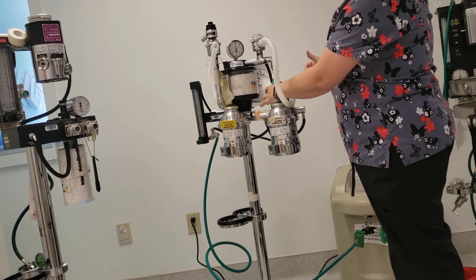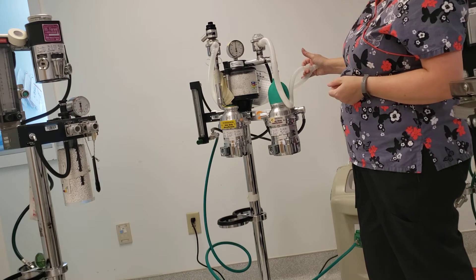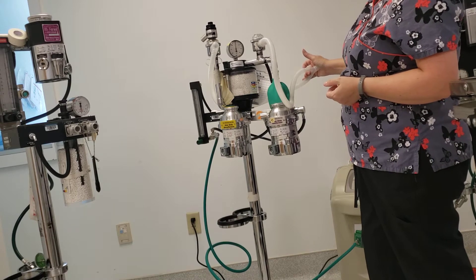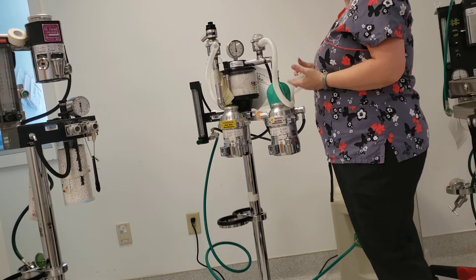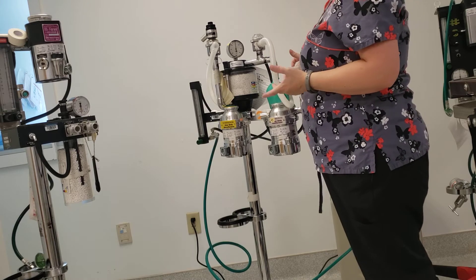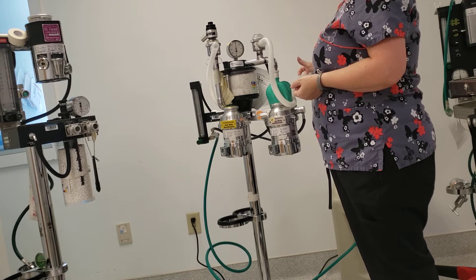Your bag's going to start filling — that's how you know it's actually working. It depends on the size of the bag you have as to how long this actually takes. If you have your flow meter set for 2 liters per minute and you have a 2-liter bag on your machine, it's going to take you 1 minute to fill the bag. If you turn your flow meter to 4 liters per minute, it'll take you 30 seconds to fill up your 2-liter bag.